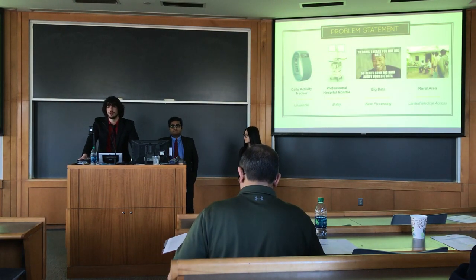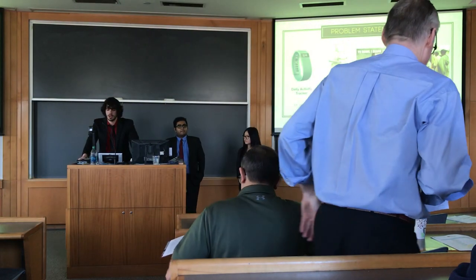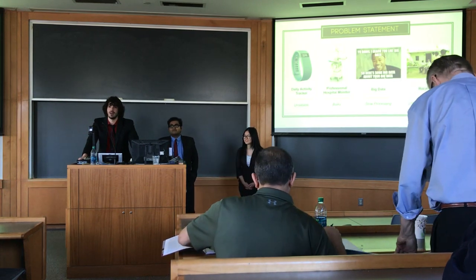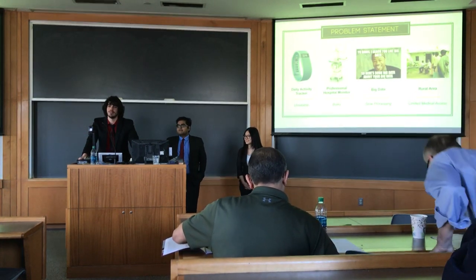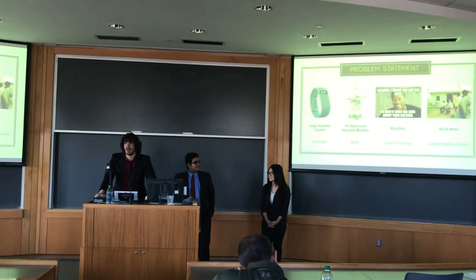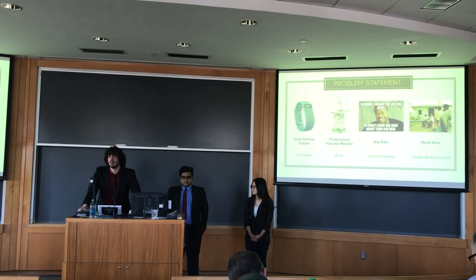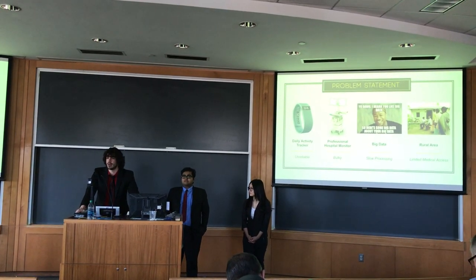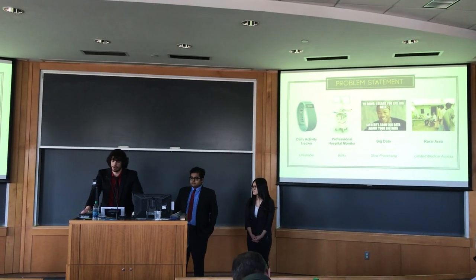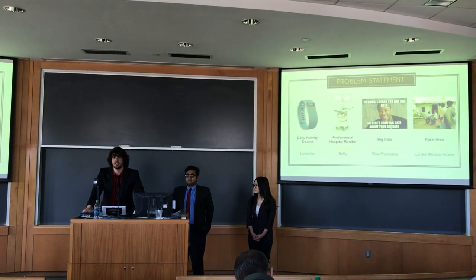Many patients, although they don't need full-time care, do need some sort of continuous vital monitor. The medical devices used in hospitals are large, bulky, expensive, and hard to move around. Wearable devices featuring medical technology typically lack the accuracy required for medical diagnosis and use only one or two sensors, limiting the range of parameters that can be extracted. A portable or fully wearable multi-parameter vital monitor would be a great benefit to patients.